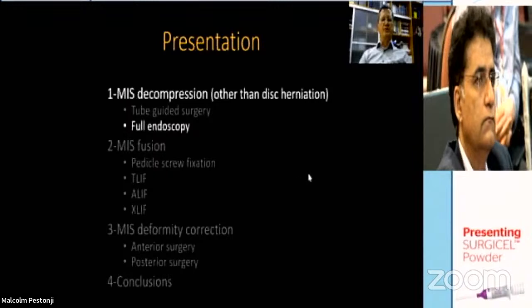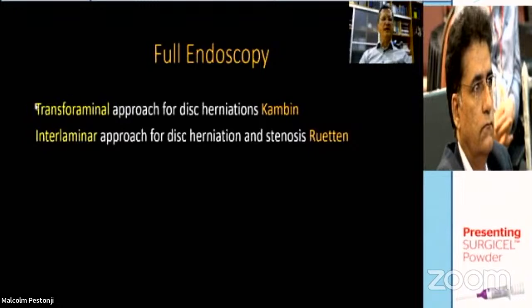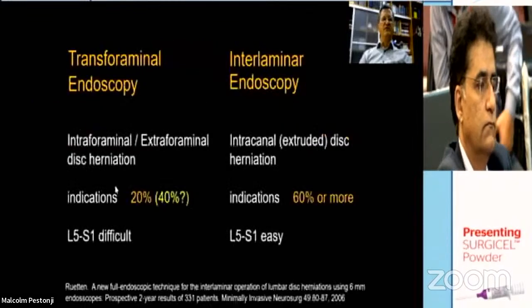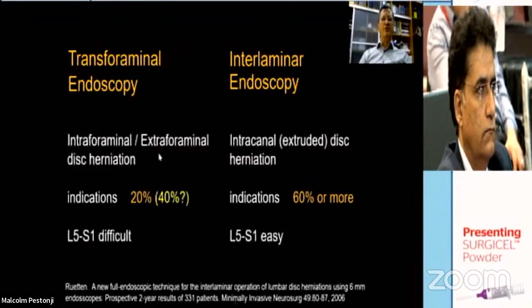There is also full endoscopy, or so-called water irrigating systems. It was first introduced by Dr. Kambin, by a transforaminal approach for disc herniations. And then more recently, Ruetten has adopted the system for interlaminar endoscopy. Actually, transforaminal endoscopy can have restricted indications. L5-S1 is difficult, and it is more proper for intraforaminal or extraforaminal disc herniations. However, interlaminar endoscopy can be more appropriate for most of the disc herniations, intracanal extruded disc herniation, and L5-S1 is easy.